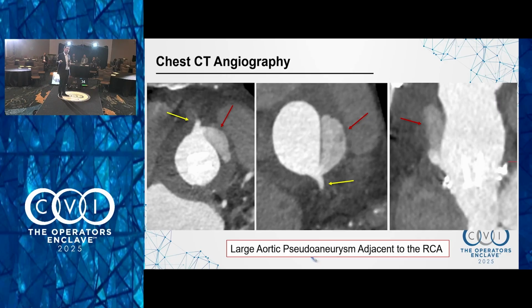You see here, that's your right with the yellow arrow, so that's the ostium of the RCA. I think where they put the suture for the right Bentall, one of those sutures might have leaked and started forming the pseudoaneurysm right next to it. So Kostas, the interpretation here is that the ostium of the pseudoaneurysm and the right coronary are shared. Is that fair? Yeah, fair. At this point it's shared. There's really not a separate pseudoaneurysm ostium.